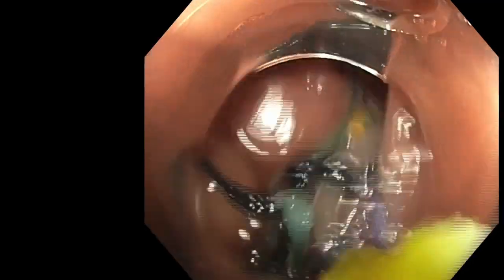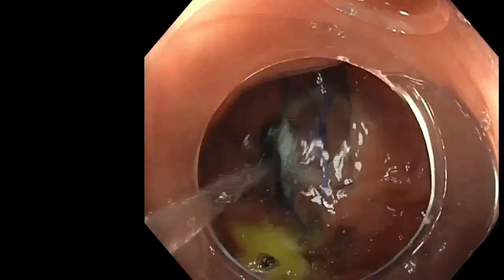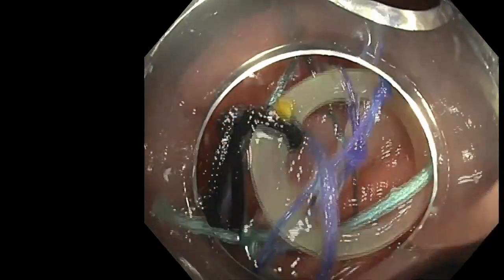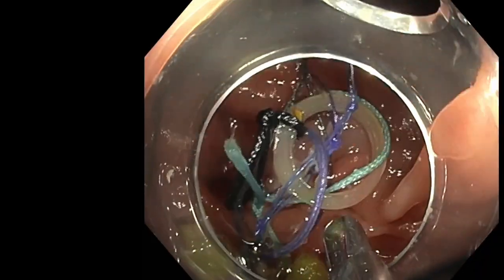So the second active loop is the blue one. So yes, again, residues, but you will see as soon as the traction changes the gravity of the lesion, we will stop the problem of residue coming into the field of view. So we use a second similar clip, once again to be able to turn it by ourselves. We try to see the second blue loop, which is the active one.